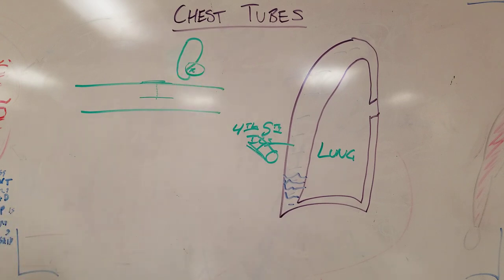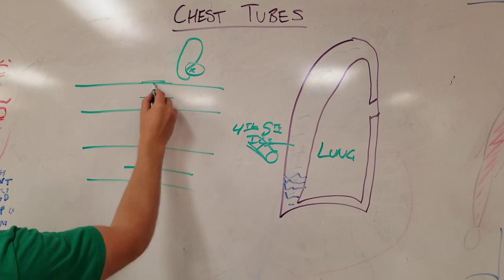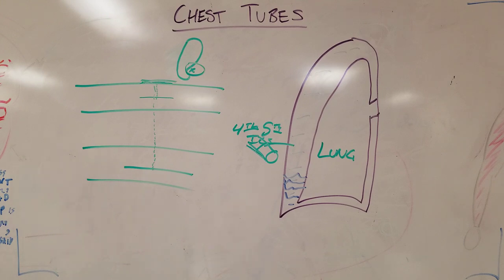Some people say you have to tunnel up a space, meaning you'd actually make your incision down here, and you'd feel this intercostal space and tunnel way up. I don't condone that process. I don't think it's shown any mortality benefit or air leak benefit. So I would just say go to the next intercostal space above you and tunnel in, or punch in, I should say.